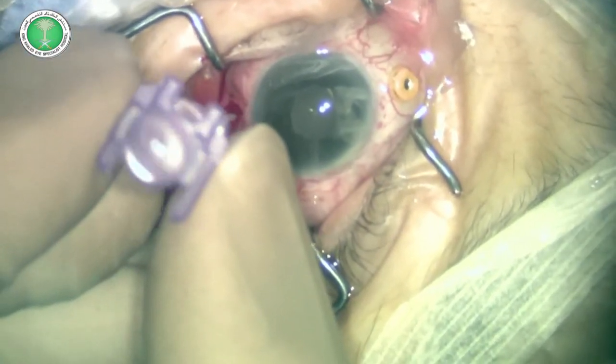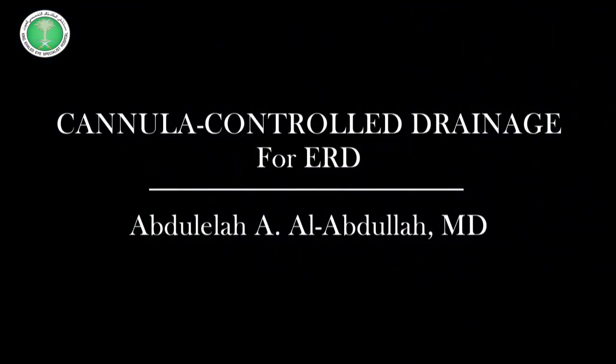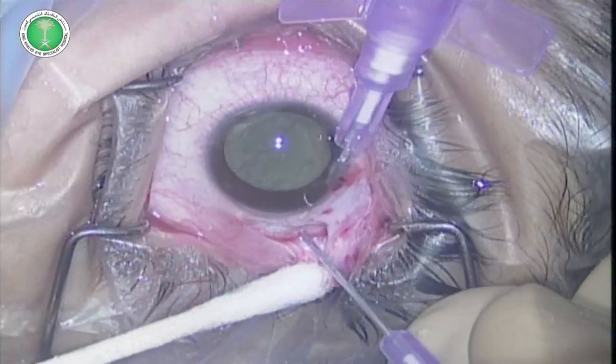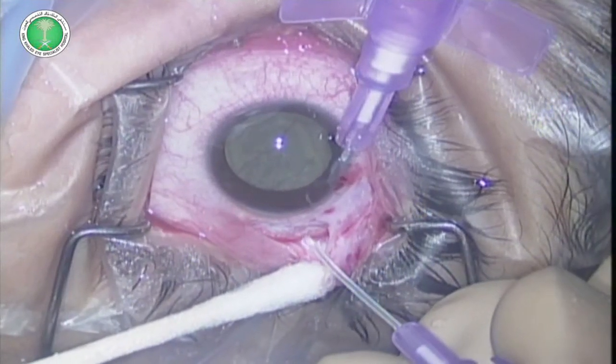This can be assisted by injecting BSS in the vitreous cavity or fixing an anterior chamber maintainer. Cannula controlled drainage can also be used for exudative retinal detachment. This is a case of exudative detachment secondary to Coats disease, where we can see the retina beyond the lens.